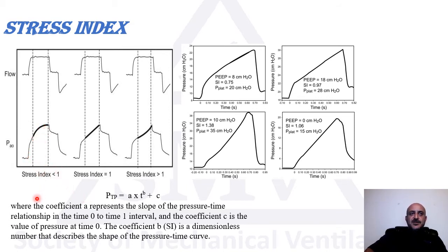To be noted, this has to be done again in a passive patient, no effort. It has to be done on the volume controlled mode with the constant flow or the square wave flow. And we look at the curve of the pressure time curve.